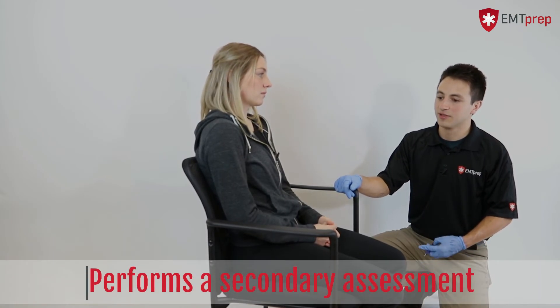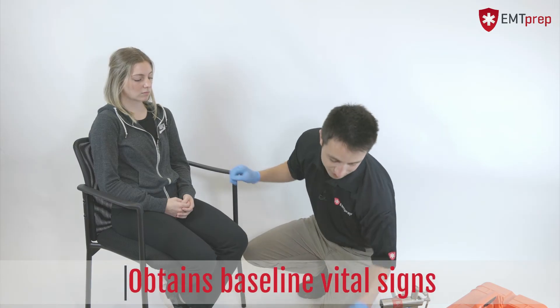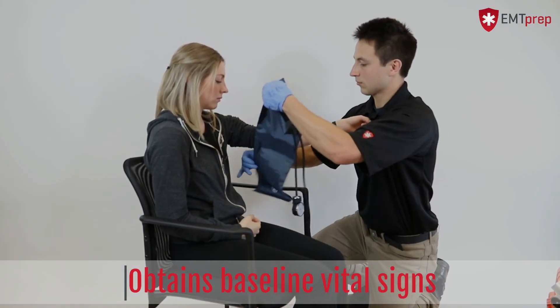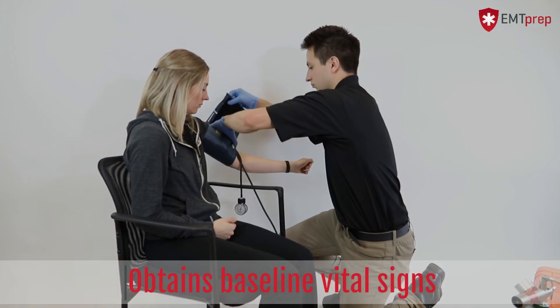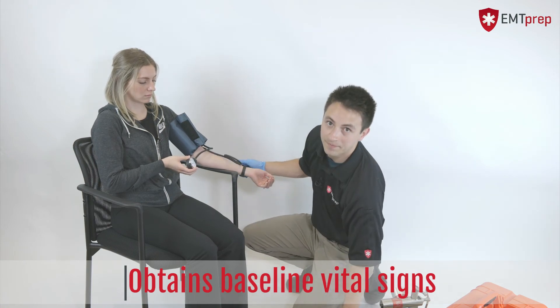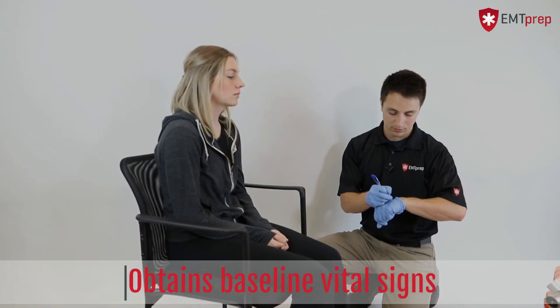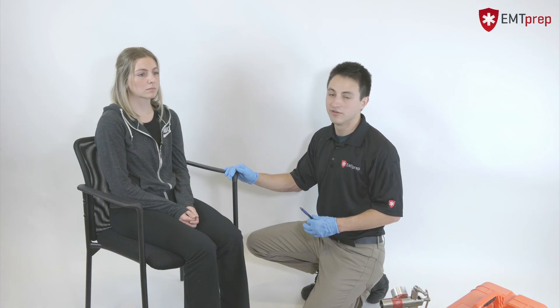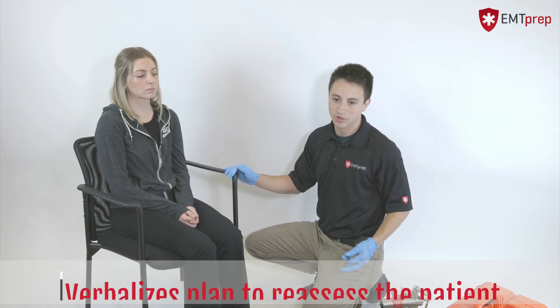For my secondary assessment, I'm thinking it's low blood sugar. I'm going to be taking some vitals at this time — blood pressure first. I got 118 over 78. I'm going to be taking a CBG at this time. Your CBG comes back at 52. My field impression is that she's having a low blood sugar, a diabetic event. My intervention is I'm going to give her 15 grams of oral glucose, the full tube. I'm going to be reassessing her every five minutes, taking a blood sugar until ALS arrives.